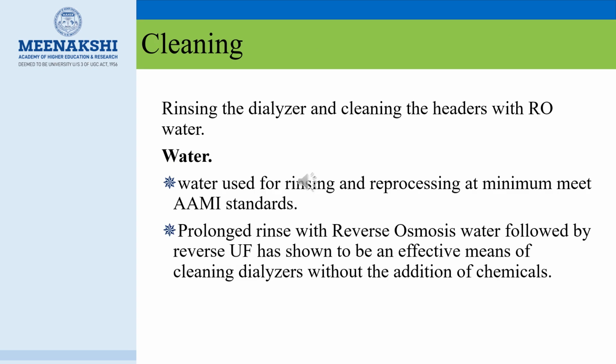Cleaning. Rinsing the dialyzer and cleaning the headers with RO water. Water which is used for rinsing should meet the minimum standard set by the AAMI. A prolonged rinse with RO water followed by reverse ultrafiltration is an effective means of cleaning the dialyzer without the addition of chemicals.